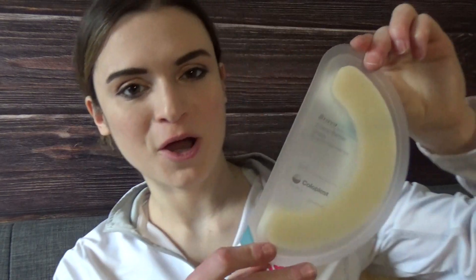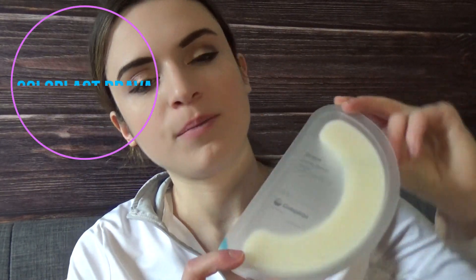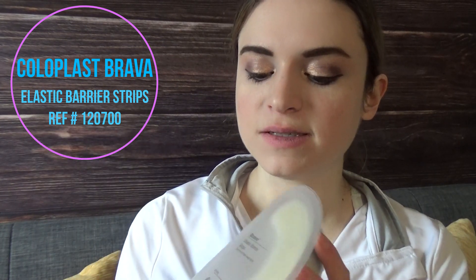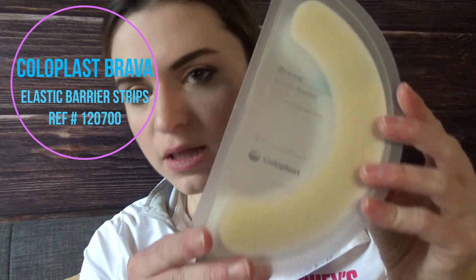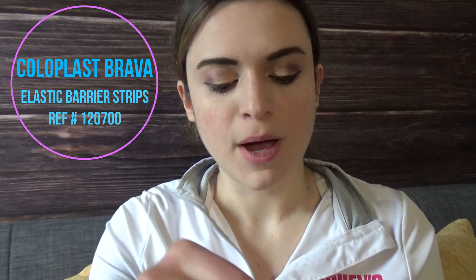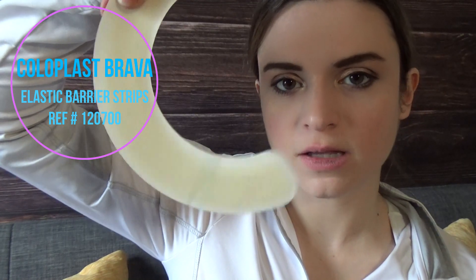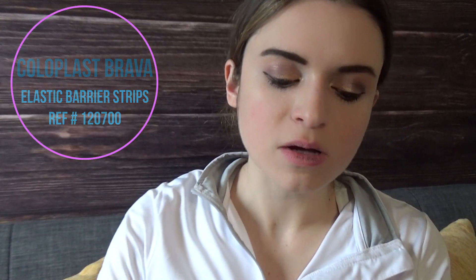Next I want to talk about Coloplast elastic barrier strips — they could not be more helpful. I've talked about them in a past video about leakage during class. This is what they look like in the package — little flexible silicone strips that you put around the perimeter of your stoma to prevent leakage.